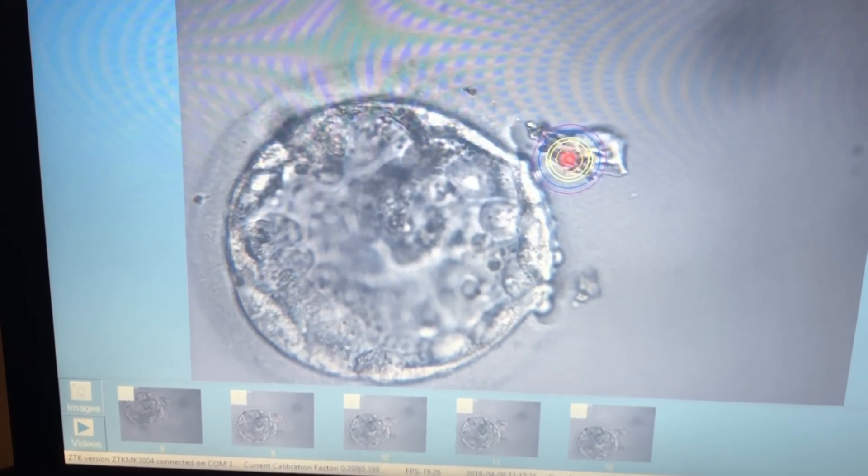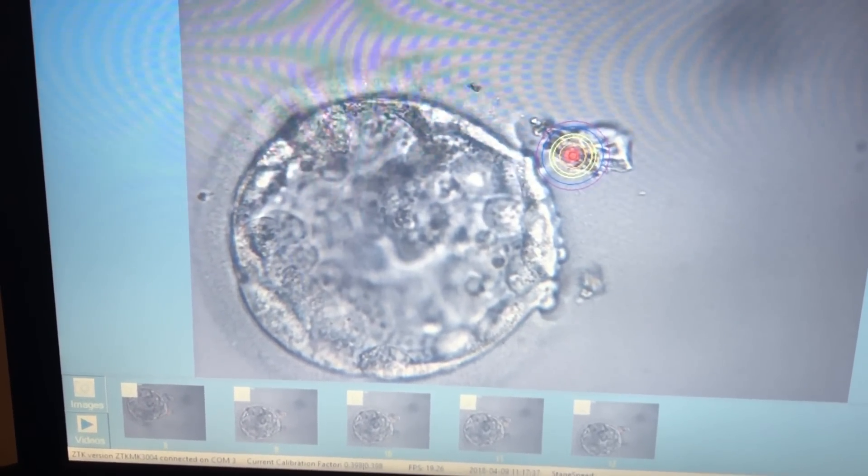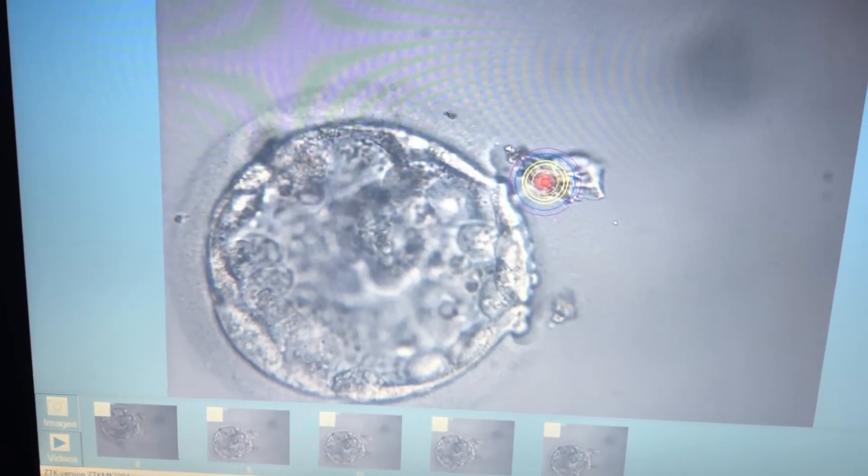Once the hatching is done, the embryo is incubated for approximately 4 hours prior to undergoing the transfer.